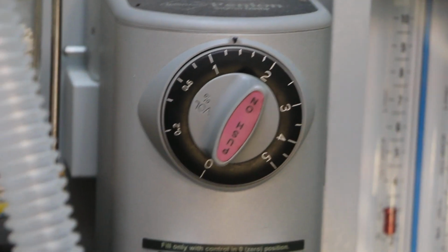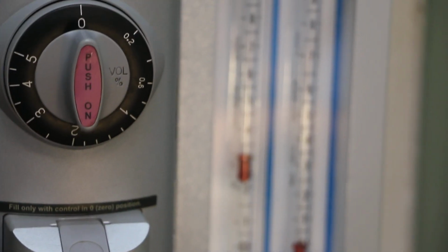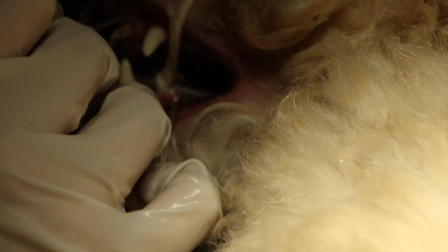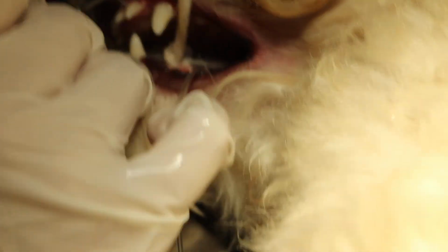Okay, so we are finishing soon, so reduce to 0 then. By the time we finish, the dog should be awake. Because the dog is on IV anesthesia as well, the isoflurane is just a supplement. Sometimes you can just do it on IV anesthesia. It's not all the time you need oxygen.